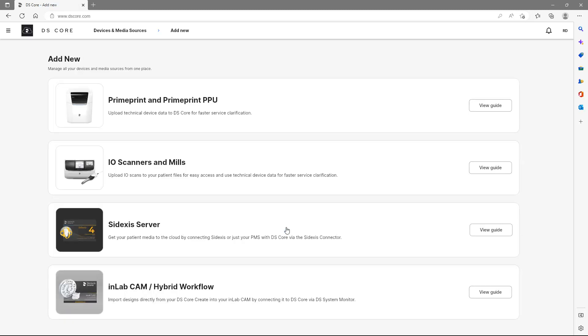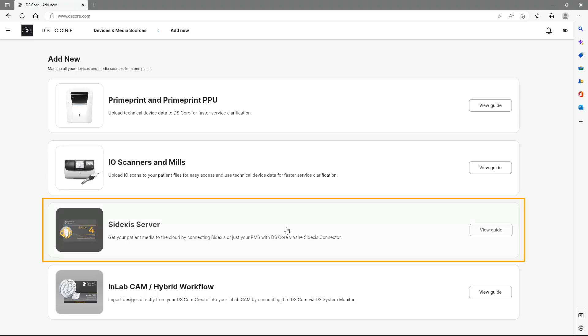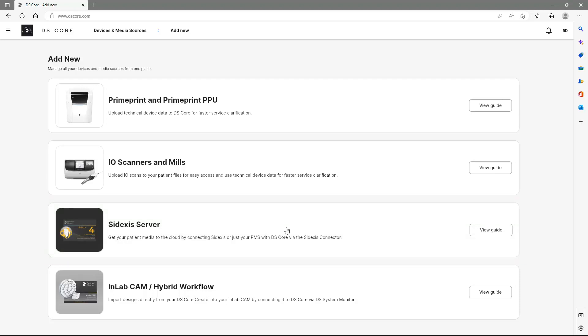You will see an overview of devices and media sources that can be connected to DS Core for secure data exchange and integrated workflows. In our case, we want to connect the practice's Sidexis server to upload case files taken with Sidexis 4 automatically. Therefore, we click on View Guide in the corresponding field.